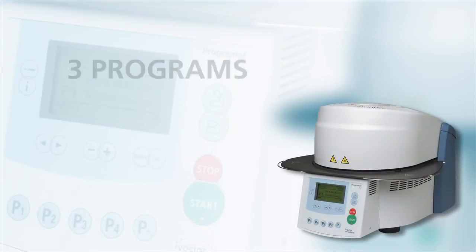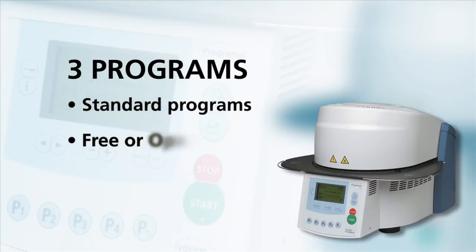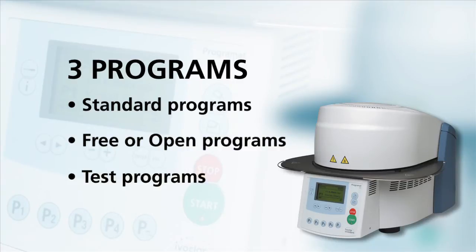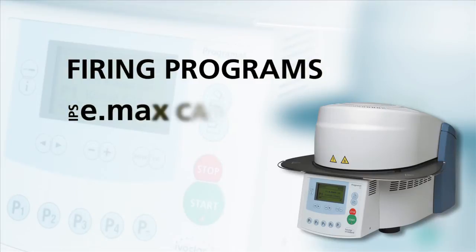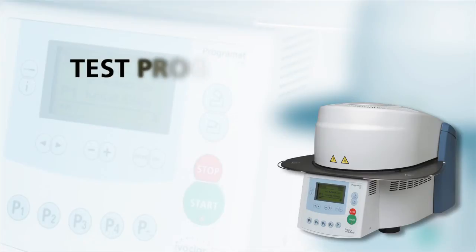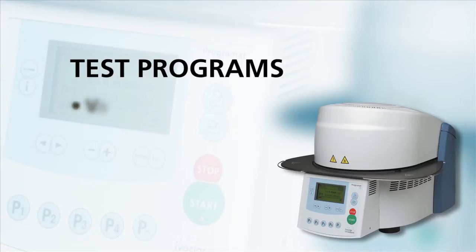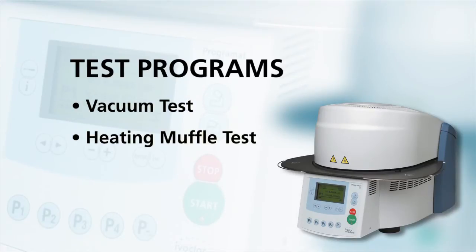The CS furnace offers three types of programs: standard programs for Ivoclar Vivadent materials, free or open programs, and test programs. The standard Ivoclar Vivadent firing programs include IPS e.max CAD and IPS Empress CAD. There are 16 free or open programmable programs available, which are full-fledged programs where parameters can be individually set. The test programs, found under Settings and Configuration, include the vacuum test, heating muffle test, and key test.